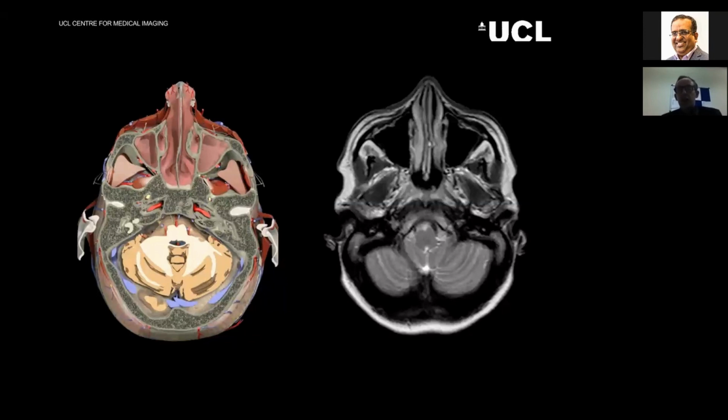So actually start thinking quite carefully about the sequences you're being shown, because when you're under pressure, and remember, none of us spend only 5 minutes looking through the whole neuroaxis on an MRI scan, but when you're under pressure, you will say things that you look back and really wish you hadn't, and we've all been there.